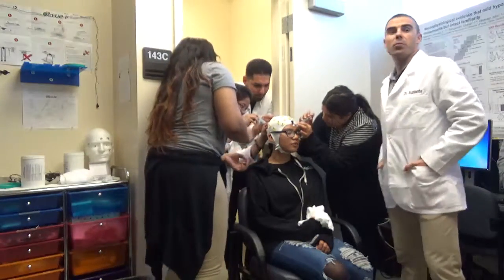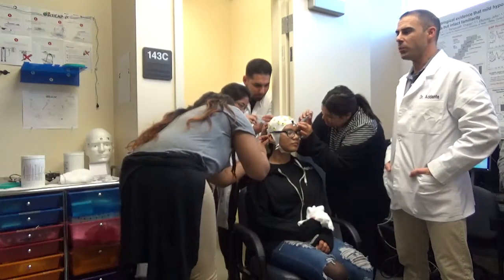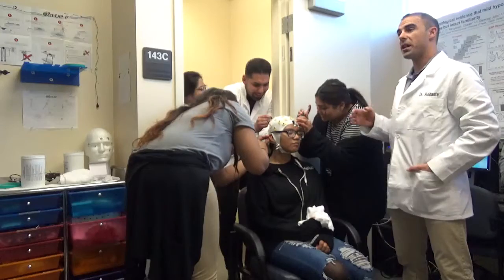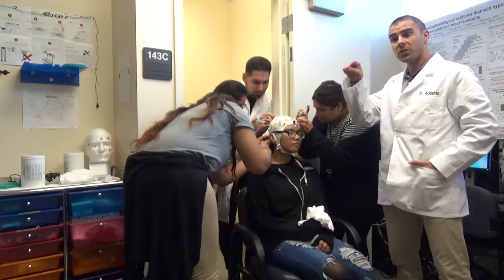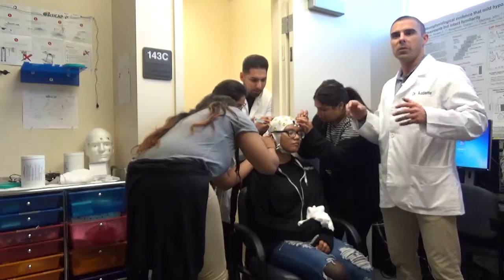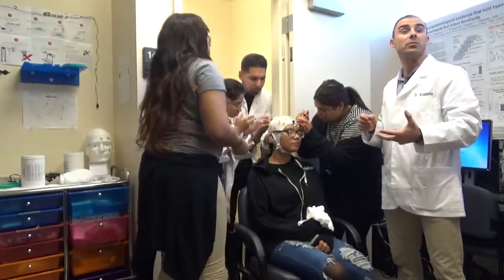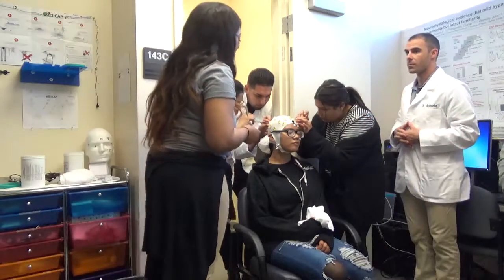Something that we'll talk about as we move forward is we'll end up later on checking what we call the impedance values. Do you feel it now? When we turn the battery on and we connect this stuff, I feel it. Right now we're not able to do that because the electrodes themselves aren't actually connected in. So we're just doing that abrasion at a casual level, and we're going to have to go in and do more of it later. You work it a little bit because it's easier access now, but we're going to come back to those in a little bit.